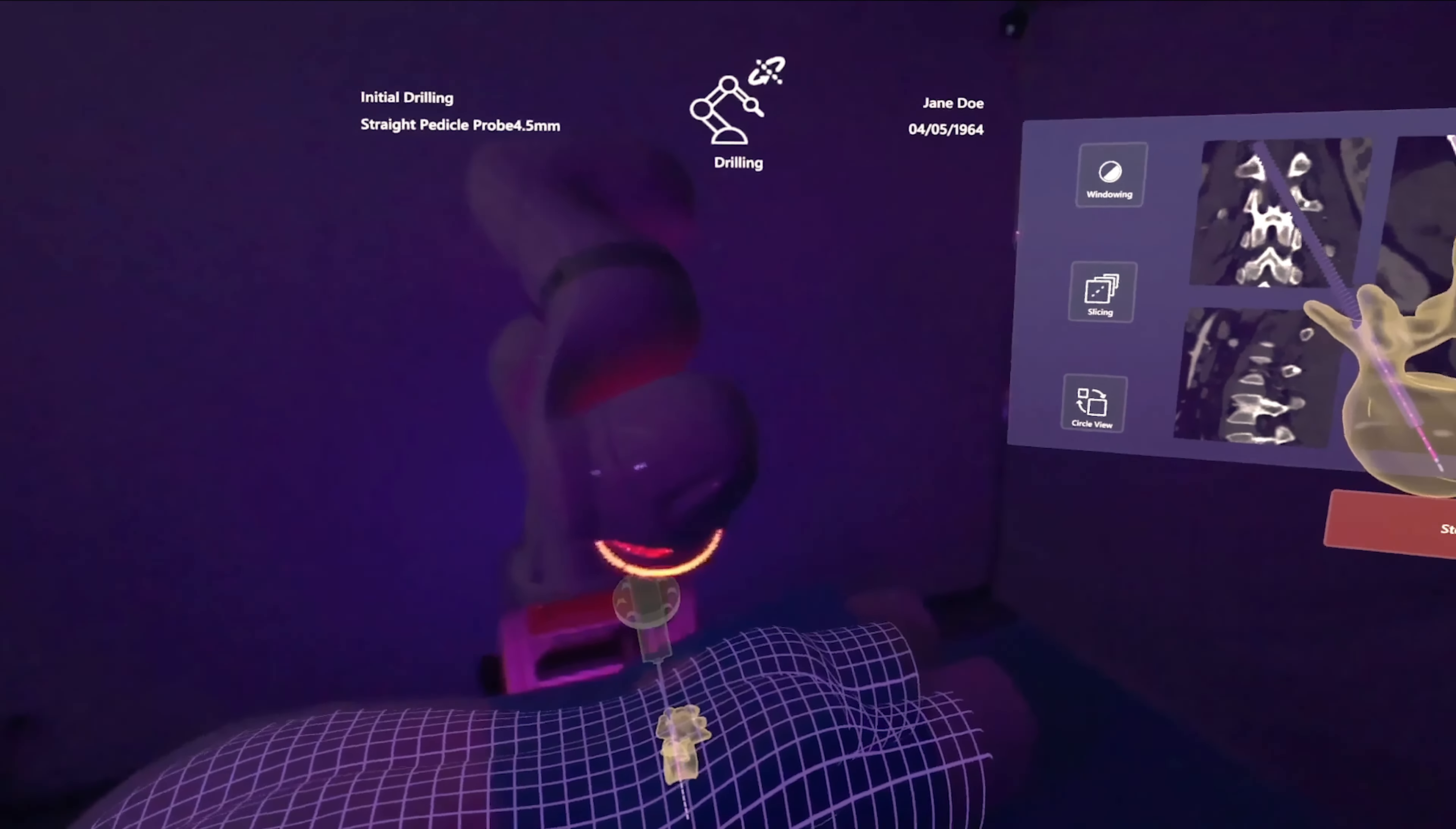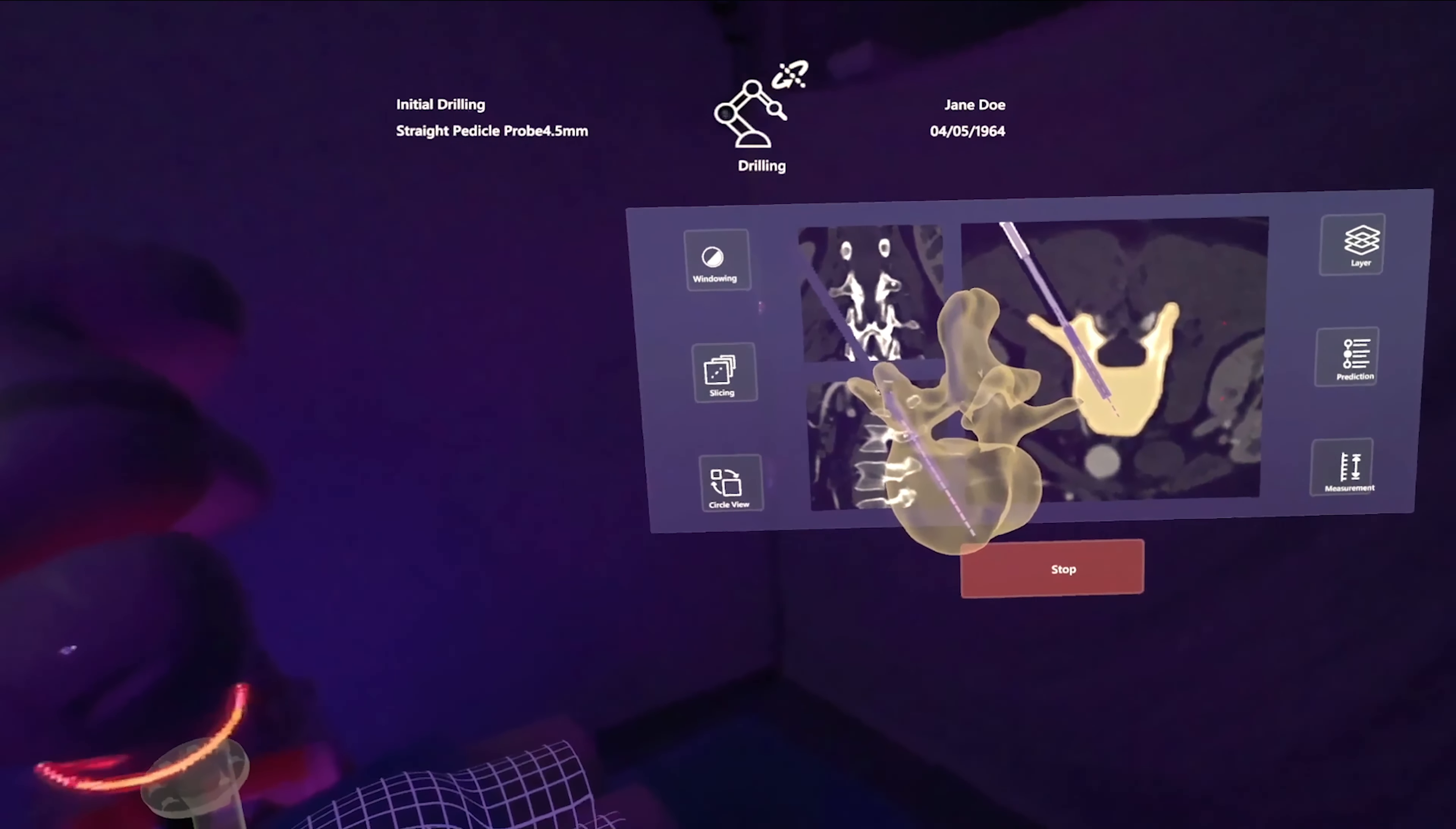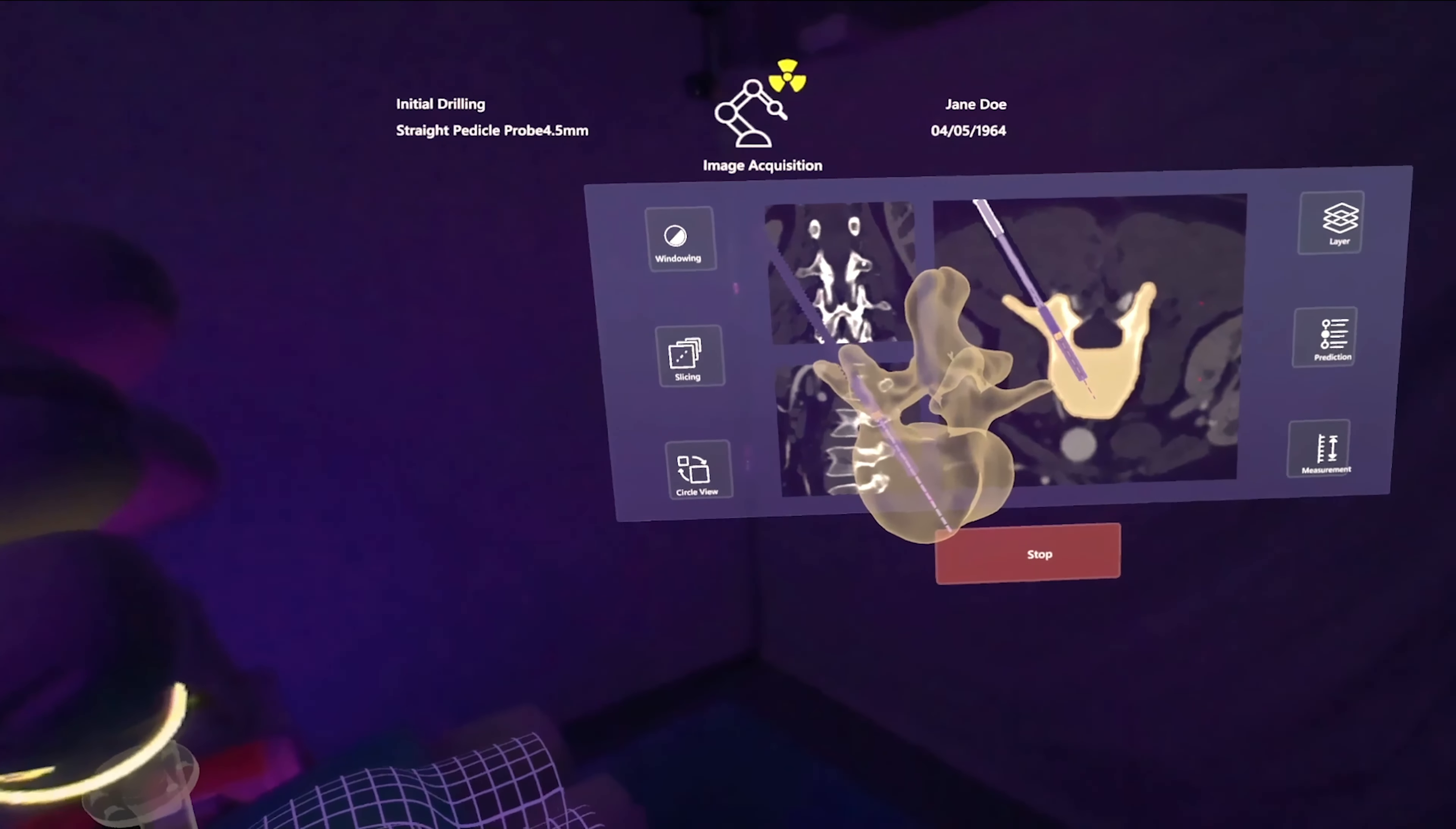Between drilling steps, the AR system shows a prediction of the next step. The surgeon can stop the process to investigate the situation further. Stop.